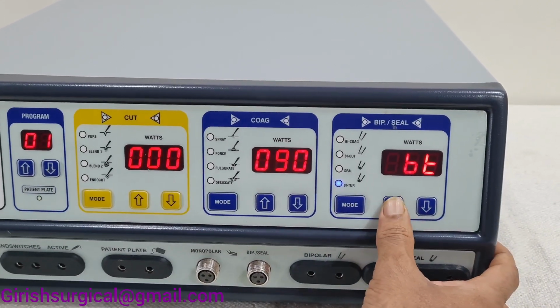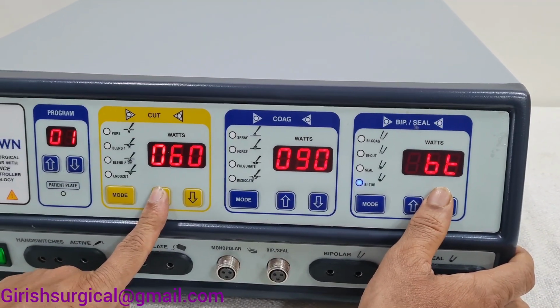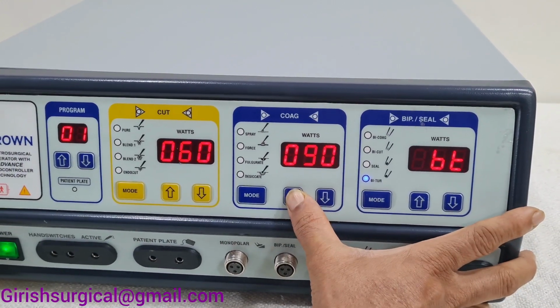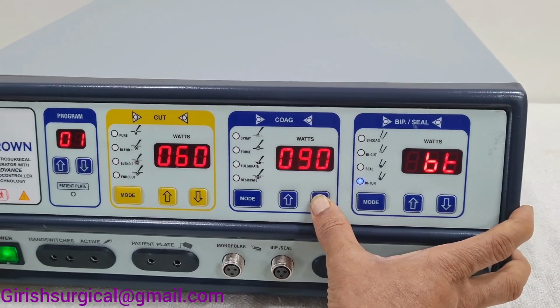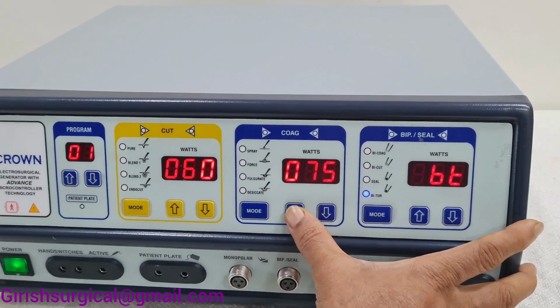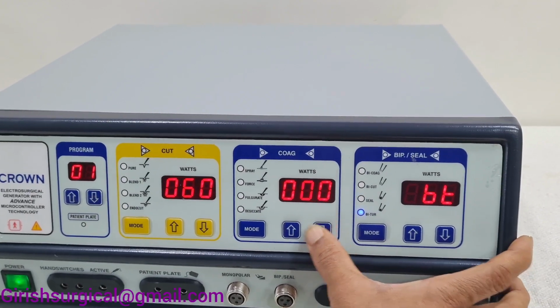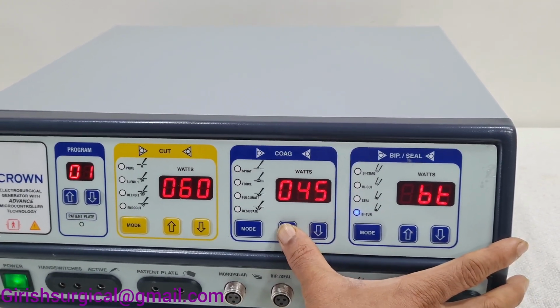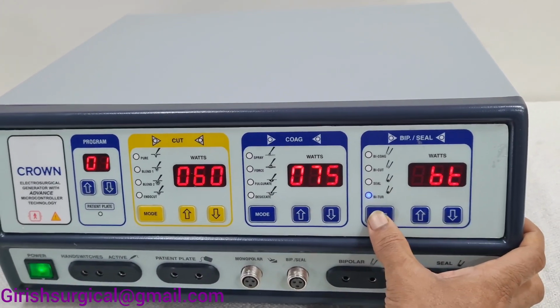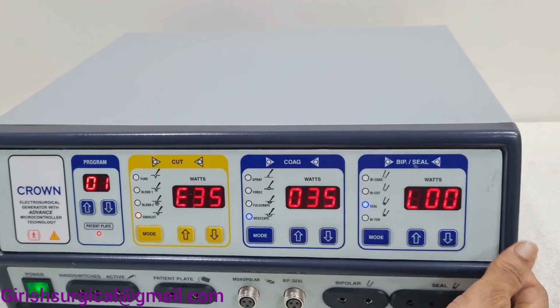In bipolar TURP, the output goes directly in steps of 20: 20, 40, 60. In coagulation, it goes 0, 15, 30, 45, 60, 75, in multiples of 15. For sealing, you can use a bipolar or the bipolar vessel sealer.